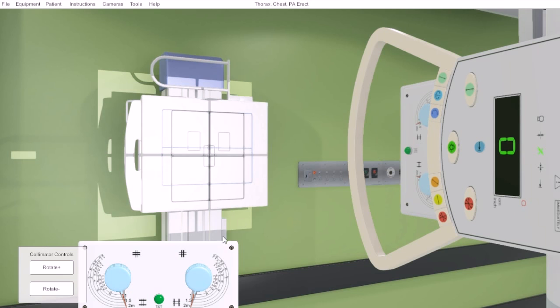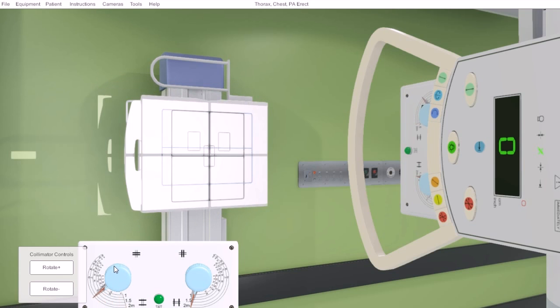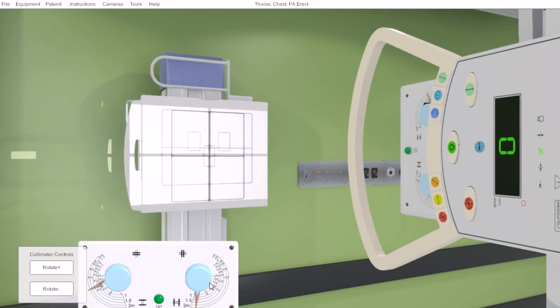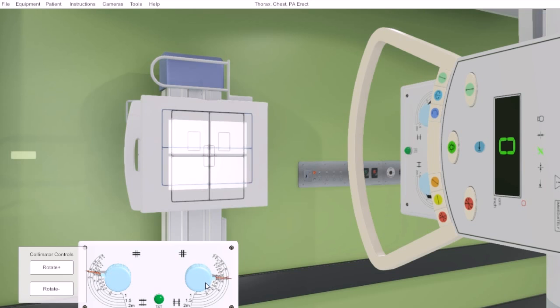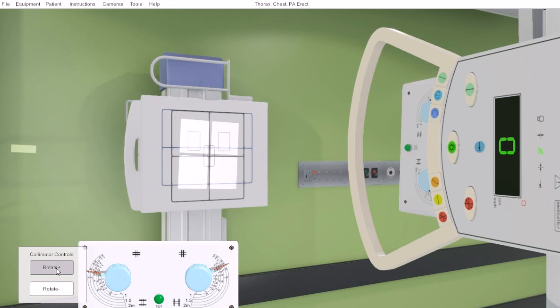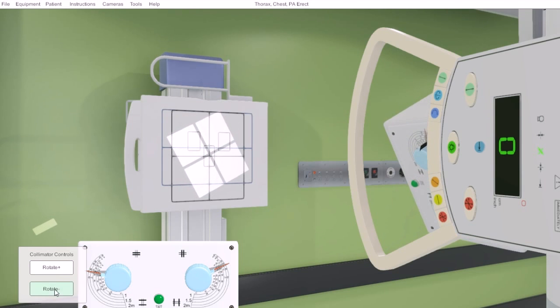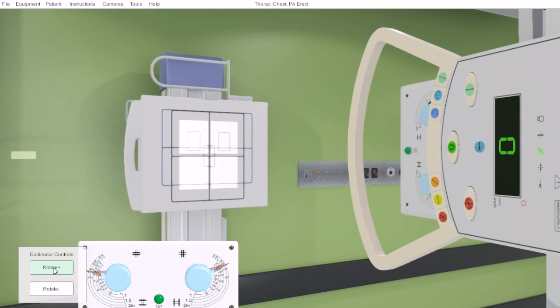Back to the collimator. By depressing the left mouse button on the control and sliding whilst still holding that button, we can bring our collimator control in. Depress the left mouse button and guide that control around. The collimator box can also be rotated as needed to adjust it to the anatomy that we wish to image, and that concludes this tutorial.